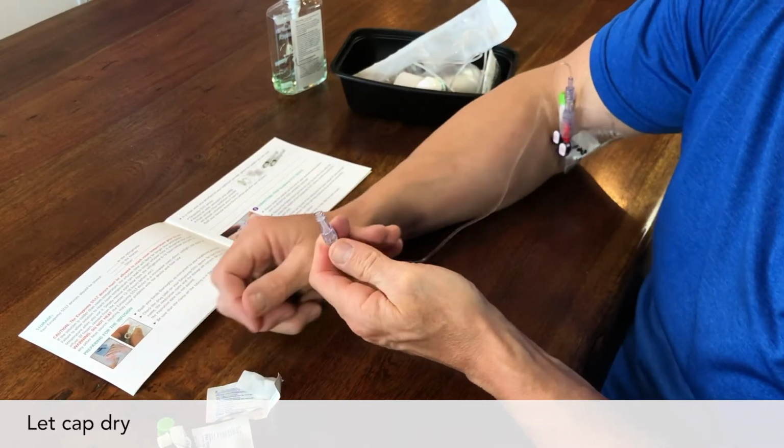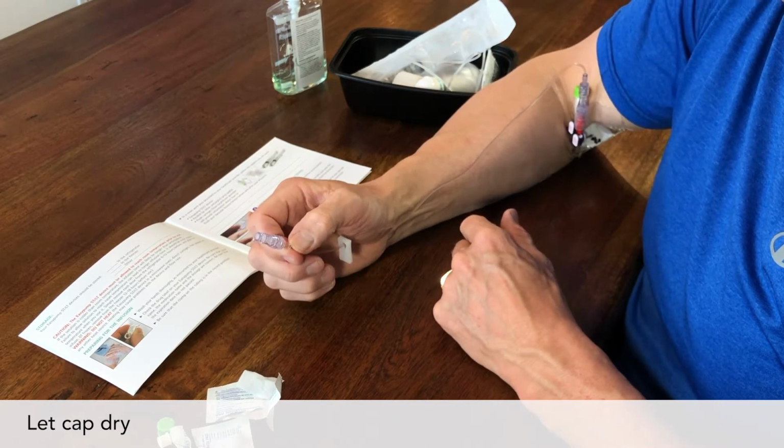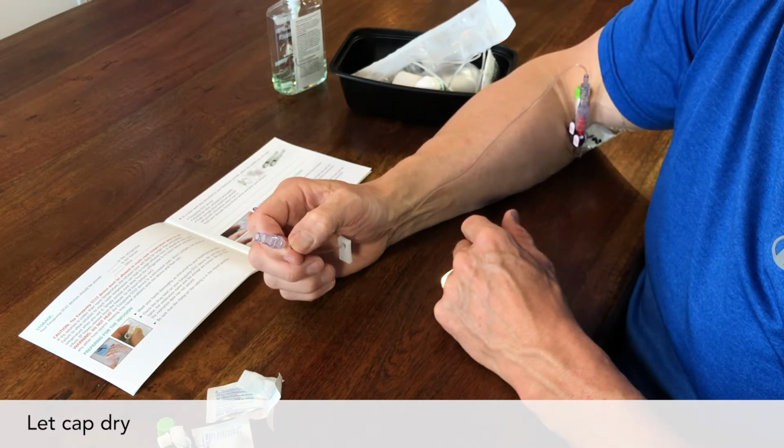Let it dry for 15 seconds. And keep holding the IV cap. Remember, this is a no-touch zone now. Watch it to make sure it stays clean. If it touches anything, you have to clean it again.